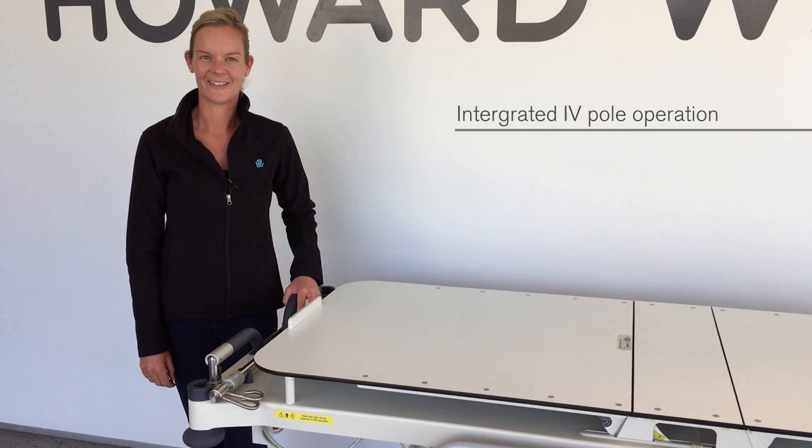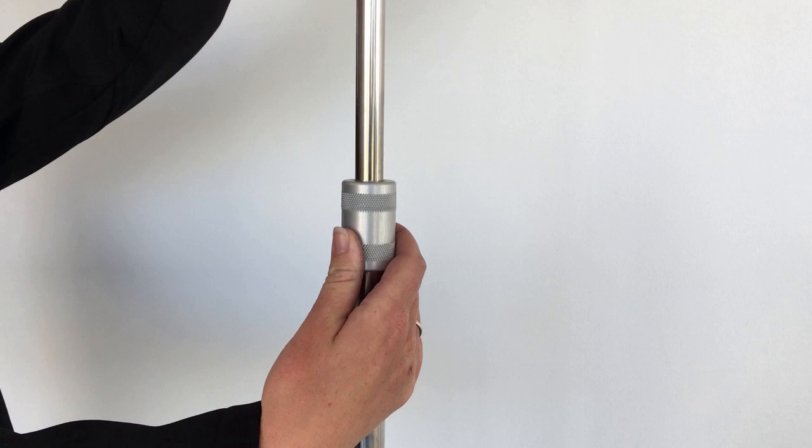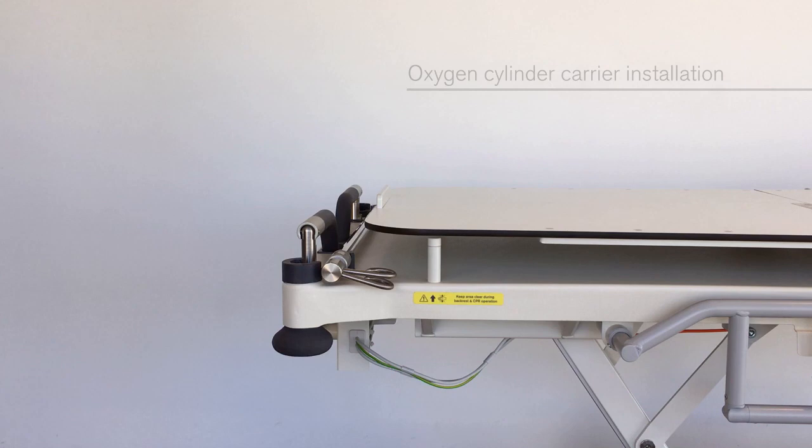An integrated IV pole is a factory fitted option at the head end. Raise the IV pole and simply lower and twist into the socket. To extend the IV pole, loosen the locking collar and move the hooks to the desired height, then tighten the collar.